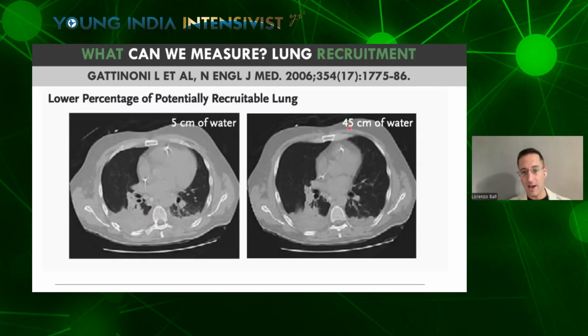If I apply a higher pressure, I do almost nothing to the collapsed regions of the lung because they are consolidated, and there's no PEEP level which is capable of reopening these heavily closed alveoli. And in this case, what we get is that the ventral region of the lung becomes more black. So we are just hyperinflating the ventral parts of the lung.